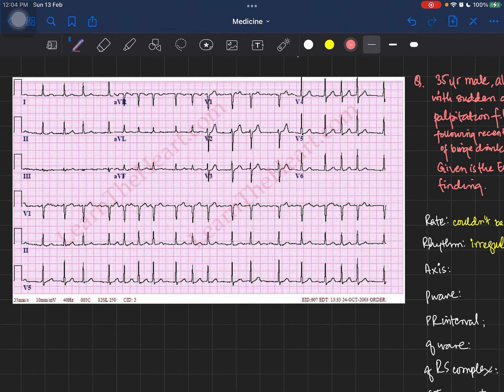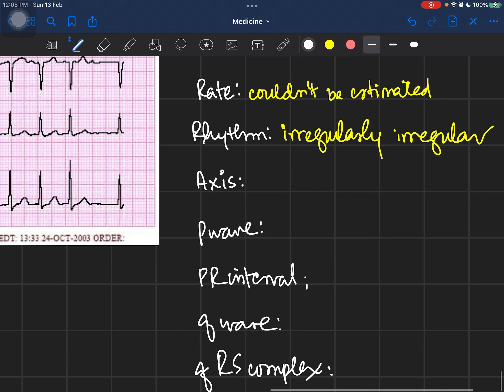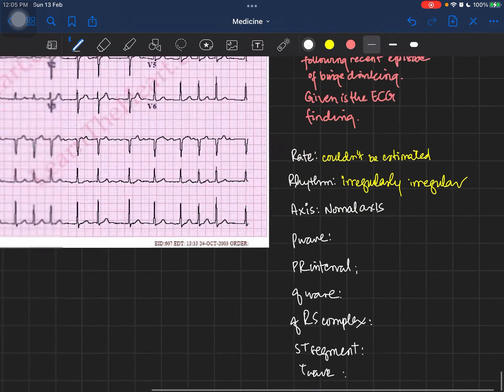Now let's look at the axis. To assess the axis we look at two leads: lead I and lead aVF. Here the R wave is more positive than the S wave in lead I, and similarly the R wave is more positive than the S wave in lead aVF. This is a normal axis — there is no axis deviation.